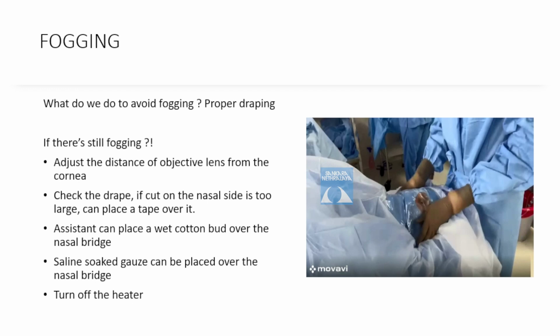Okay? And using the Tegaderm, whatever you're comfortable with, you can do. These days, what I was doing here is cutting it into two halves and sticking it directly along the margin, not over the eyeball. That seems to hold it better than trying to stick it across the eyeball, because anyway, the plastic drape which you're opening is covering the lid margins. So the Tegaderm is being used mainly to stick down the blue drape's margins so that they won't get lifted up. Okay. Anyway, whatever you're comfortable with, you can do.